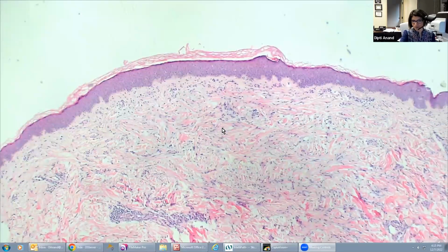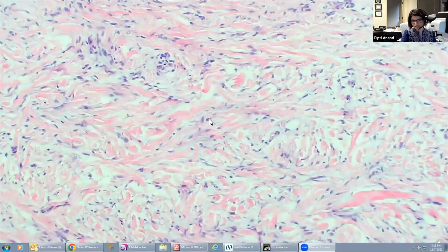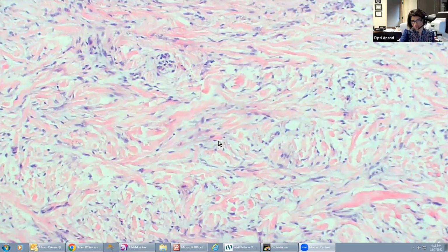So you can see that this particular papule has all these increased nuclei. And the nuclei are because the fibroblasts have proliferated. So you can see that there is an increase in the number of fibroblasts. So all these spindle nuclei, the fibroblastic nuclei, they have laid down the collagen. So there is fibrosis as well. So you can see the thickened collagen bundles. There is mucin and there is inflammation. So essentially everything is increased. You have fibroblastic proliferation with increased fibrosis, you have inflammation, and you have mucin deposition.